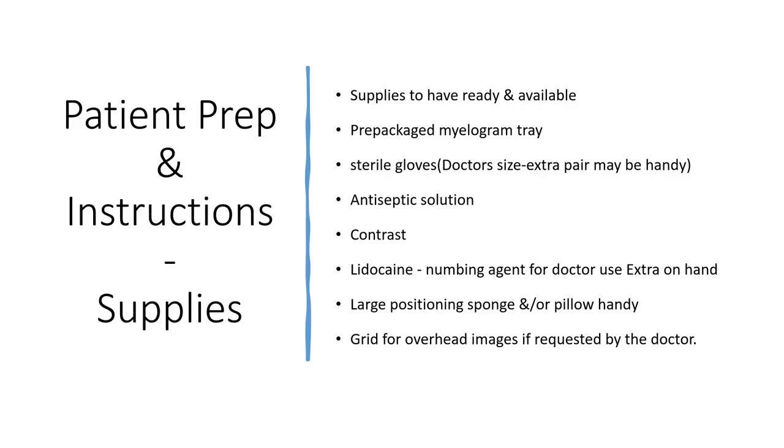Patient prep and instructions. Supplies. Supplies have to be ready and available. A prepackaged myelogram tray is usually used. Sterile gloves for the doctor; know what size they wear. Antiseptic solution, contrast, lidocaine. This would be an extra bottle. Usually your packaged myelogram tray comes with a small 5 or 10 milliliter lidocaine. You might want to grab extra just in case.